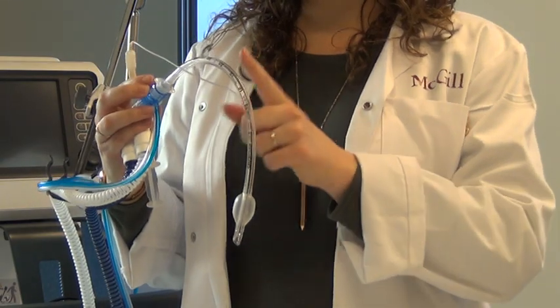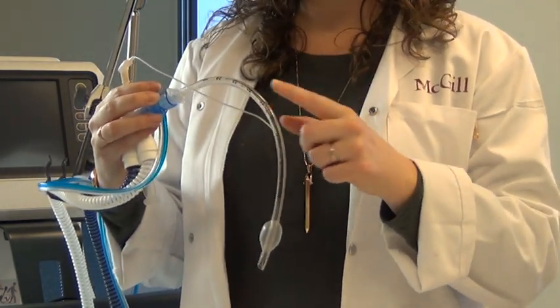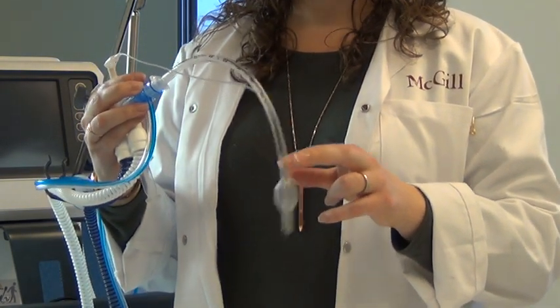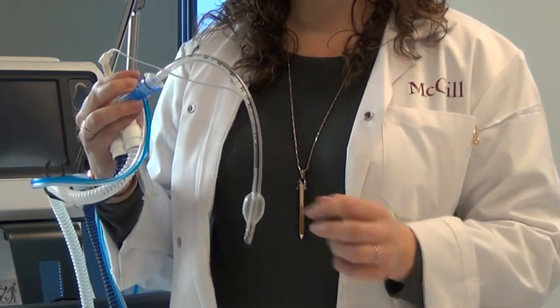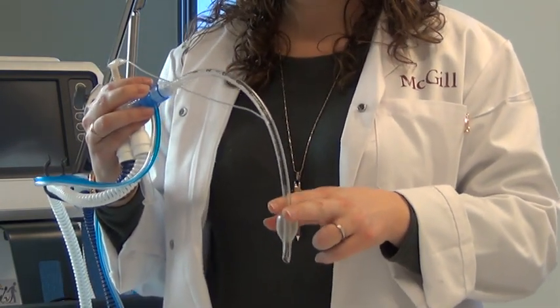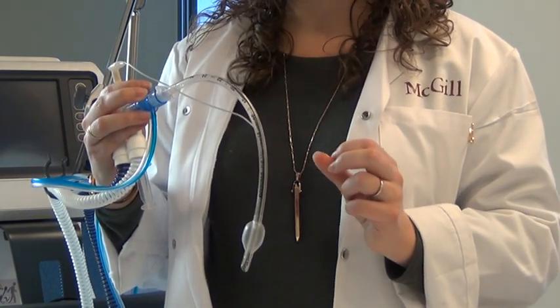It does also allow that from the mouth, that is around like here, any secretions that we have in the mouth that may drop down above the cuff here will not just fall into the patient's lung and potentially cause a pneumonia. They may actually end up sitting just on top of the cuff, and we with the suction catheter can actually go and suction out those secretions as needed.